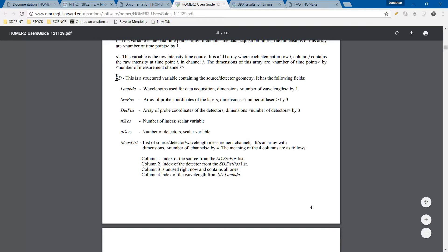The SD variable is very important. You're going to have SD.Lambda, SourcePosition, DetectorPosition, Number of Sources, Number of Detectors, and this MeasList variable, which is going to actually be the channels. That's actually going to be the number of channels as a row dimension.